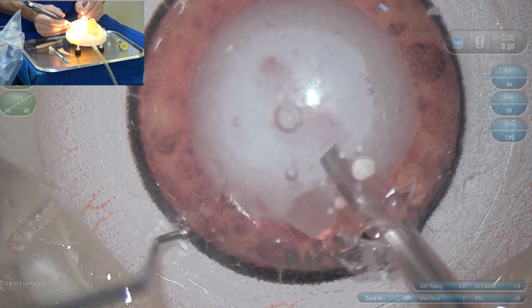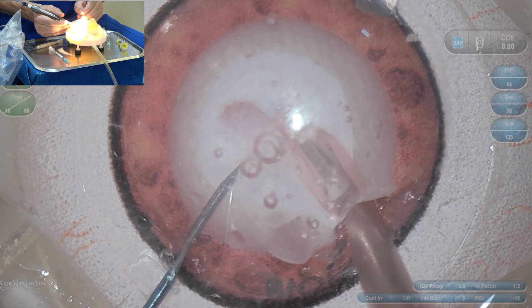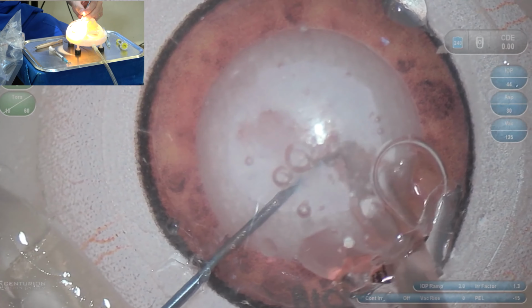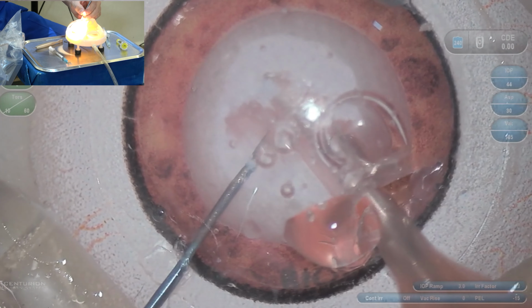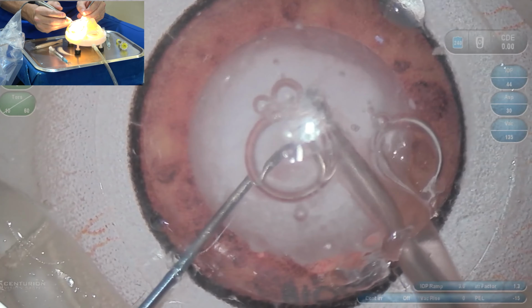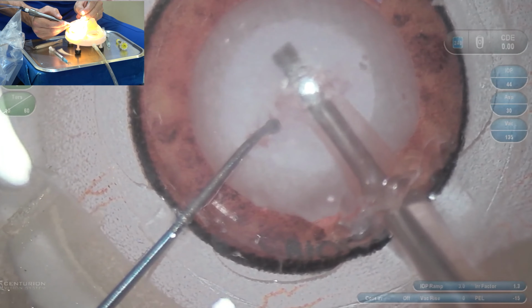What's happening here is we had normal eyes, normal parameters for an eye, but this cataract behaves very, very hard. Look how difficult it is for me, so I'm going to use more aggressive parameters, because this behaves like a very, very hard cataract. So I'm raising my parameters, as you can see in the screen, and look now how it's going to be much easier. There you go. Let's center the eye and zoom out a little bit so you can see perfectly.